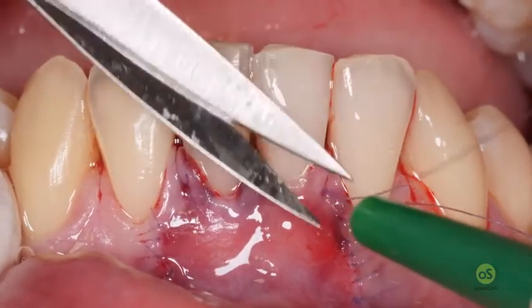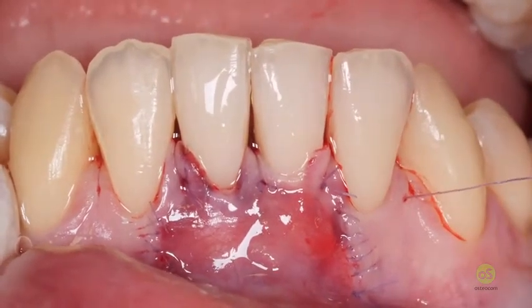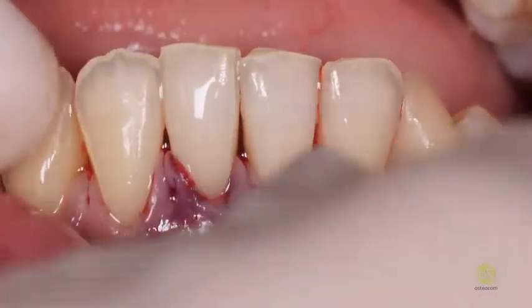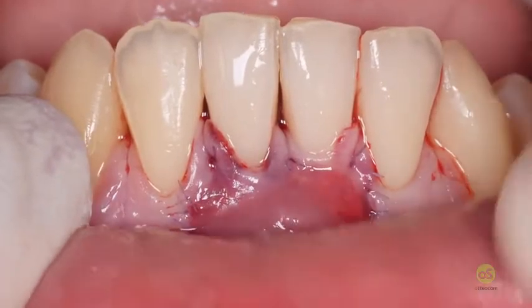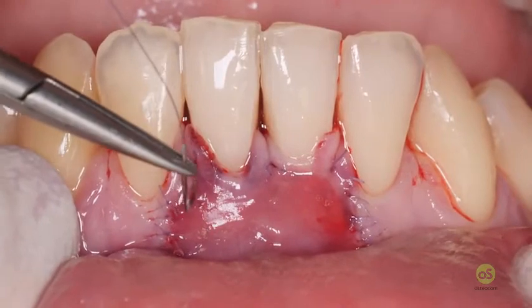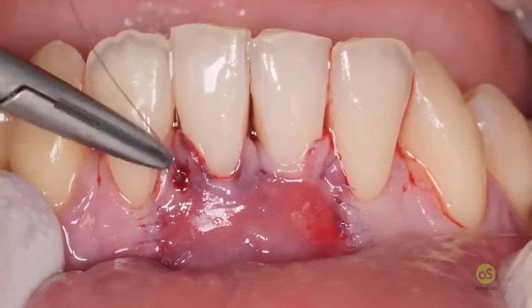And now I can finalize the removal of the first sutures, and now we do the same on the second one. In order to avoid positioning again the surgical papilla in the middle, surgical, anatomical, lingual aspect.